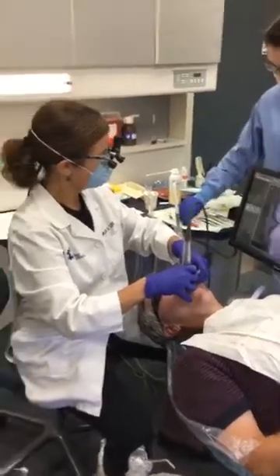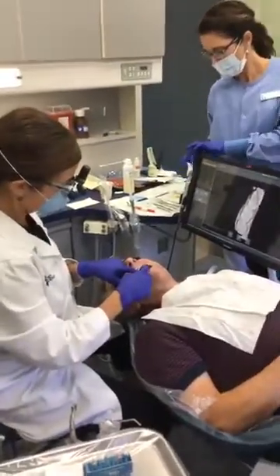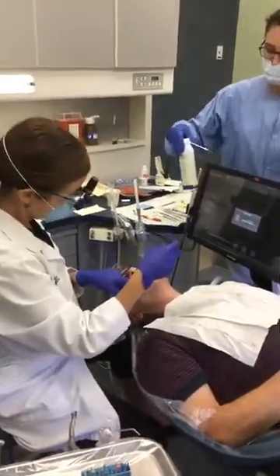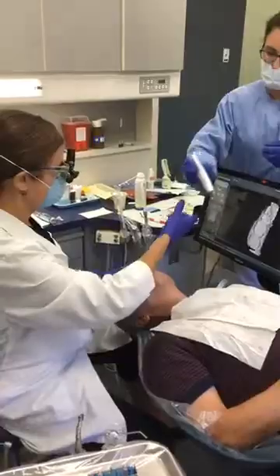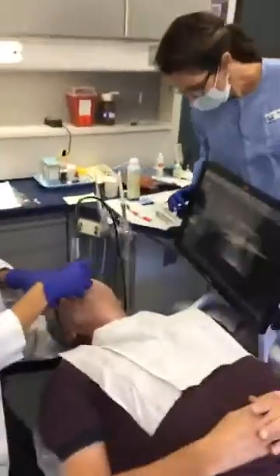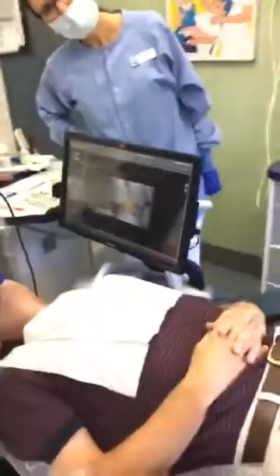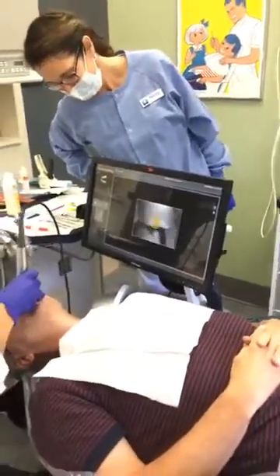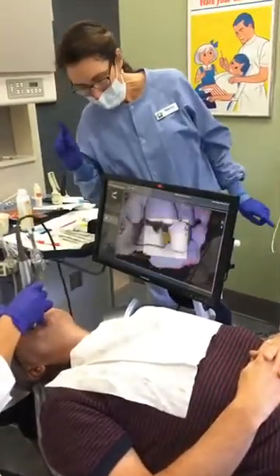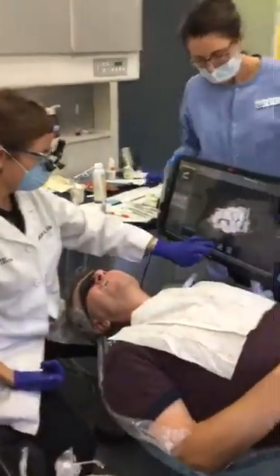You get instant feedback and the lab loves it, because the fit of the permanent crowns is awesome. Now we're going to scan for a bite and then we're done. Scan and hit the right bite — just keep biting, bite tight. Facebook community, do you see how that's coming up on the screen there? That is the bite. Register the bite.